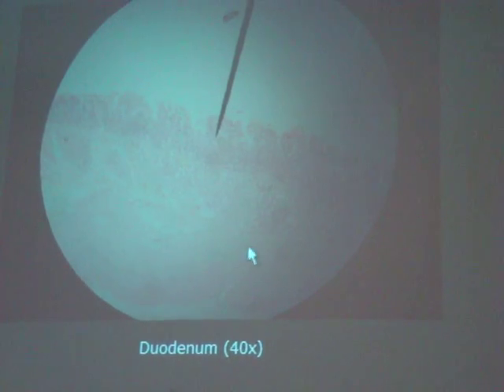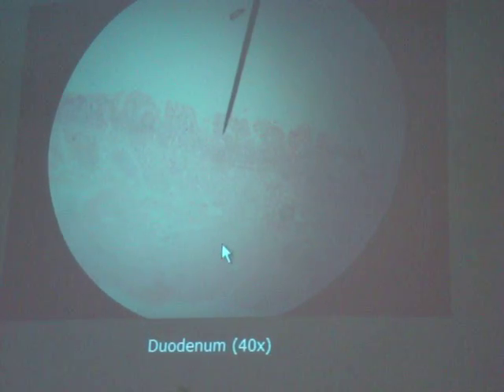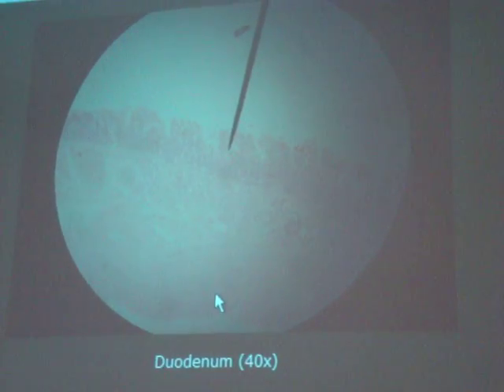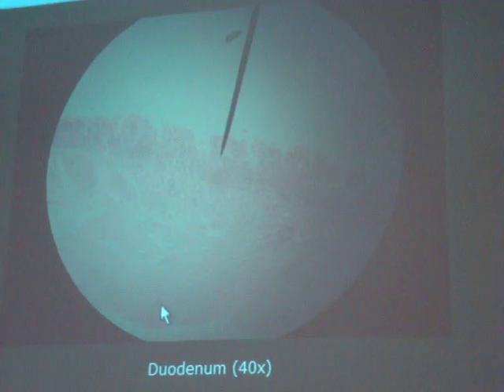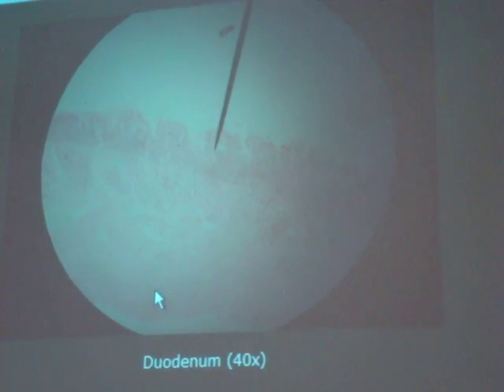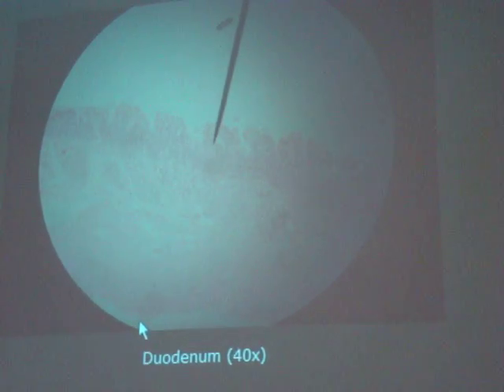So this is going to be the inner muscle layer right here. That runs from about right there down to there. Okay, so that's the inner muscle layer, innermost to the lumen. This is the outer muscle layer right here. Between these two, you see how there's a different color? Everybody see that? Okay. So the outside is the serosa, just that single layer.